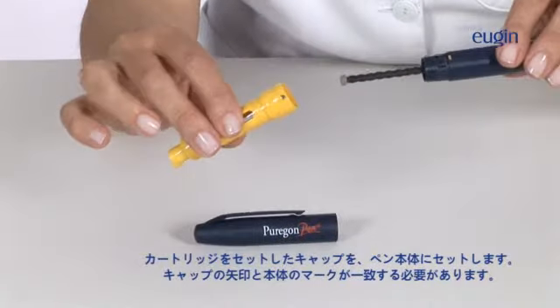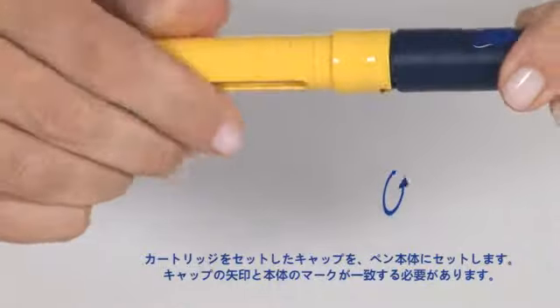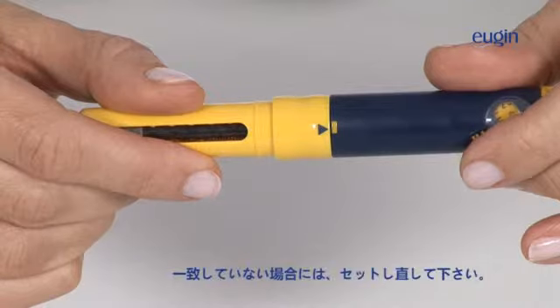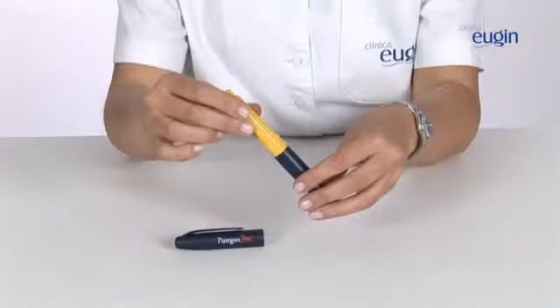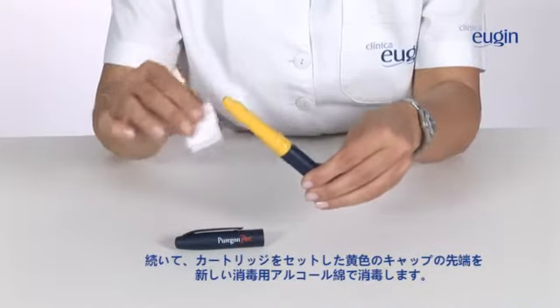Screw the cartridge holder into the pen, making sure that the arrow coincides with the mark. Make sure there is no gap between the two parts. If there is, repeat the process. Then, clean the end of the yellow cartridge holder with another alcohol swab.